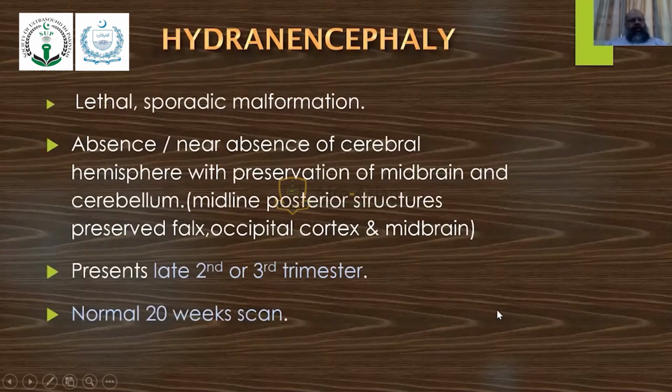Hydranencephaly is a lethal, sporadic malformation, absence or near absence of cerebral hemispheres with preservation of midbrain and cerebellum, midline posterior structures, preserved falx, occipital cortex, and midbrain. Presents late second or third trimester, normal 20th week scan.